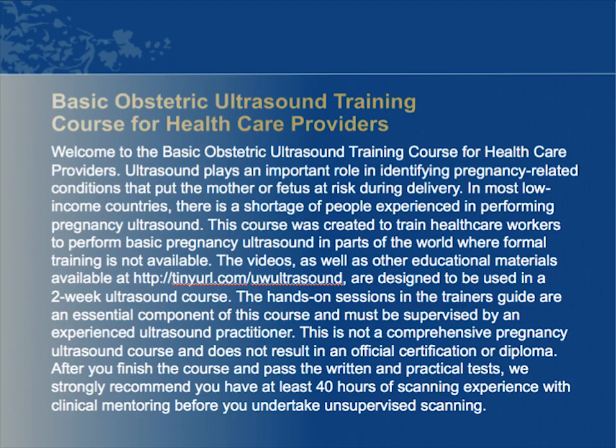This course was created to train healthcare workers to perform basic pregnancy ultrasound in parts of the world where formal training is not available. The videos, as well as other educational materials, available at tinyurl.com/UW ultrasound, are designed to be used in a 2-week ultrasound course.